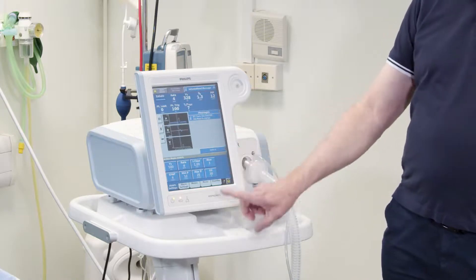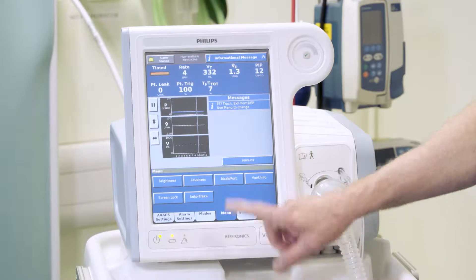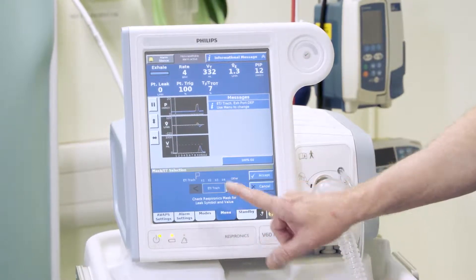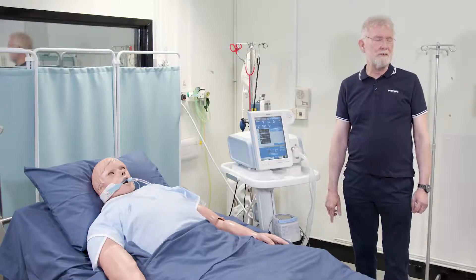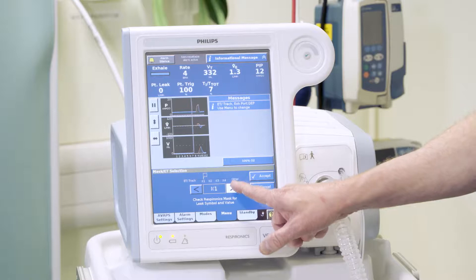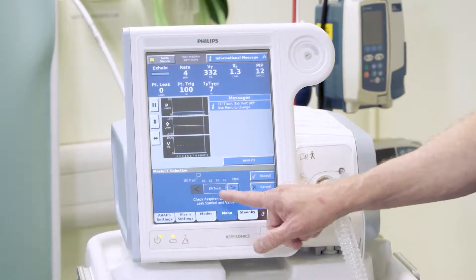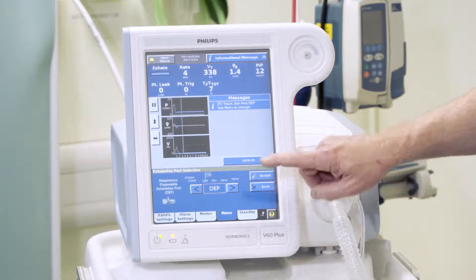To address the two issues we need to answer, if I open the menu there is a box that says mask/circuit port. If I open that it starts off with the interface. If we're going to use it invasively, we look for the ET/trach setting and press accept.